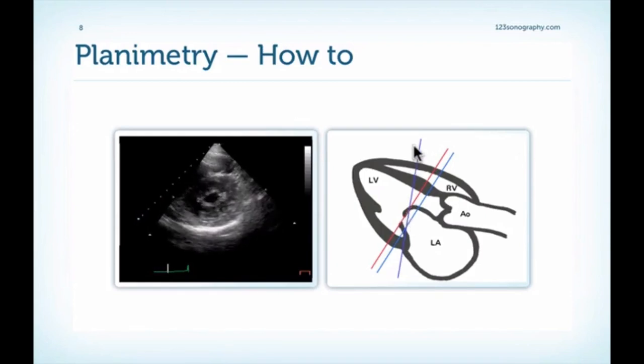If you cut the plane of the mitral valve more obliquely, you will obviously overestimate the size of the mitral valve orifice. If I want to see if a student is good at echocardiography, what I let them do is quantify the severity of pulmonary hypertension, in other words, get the TR signal. And the other thing I let them do is planimetry of the mitral valve. Why? Because both of these things are very difficult. Here's a demonstration which shows you why it is difficult.